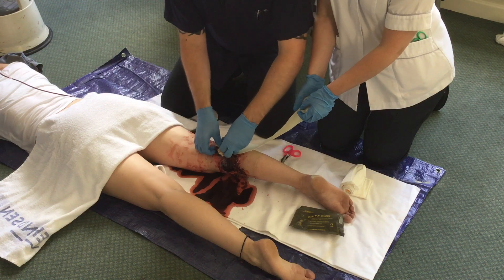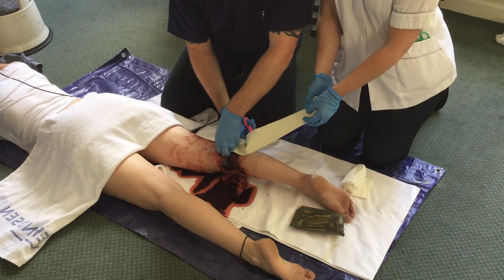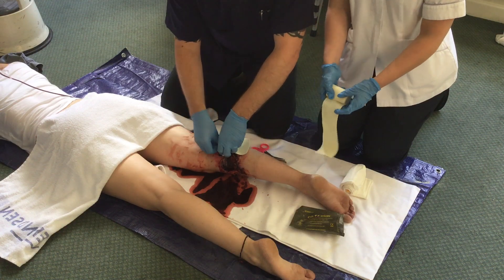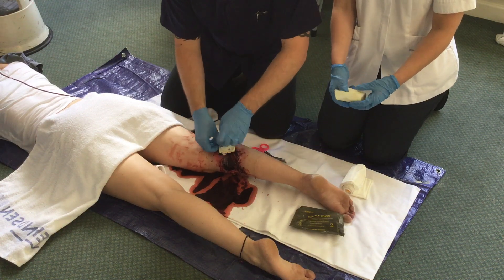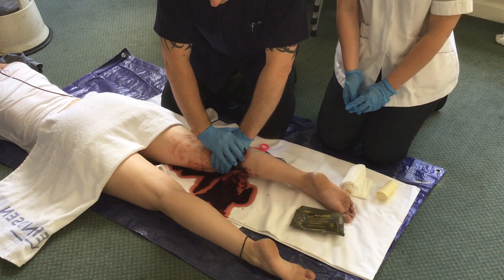When the operator is happy that the wound is full, the CELOX gauze may be cut in order to reduce the length of gauze in the wound. Pressure is then applied firmly for five minutes.